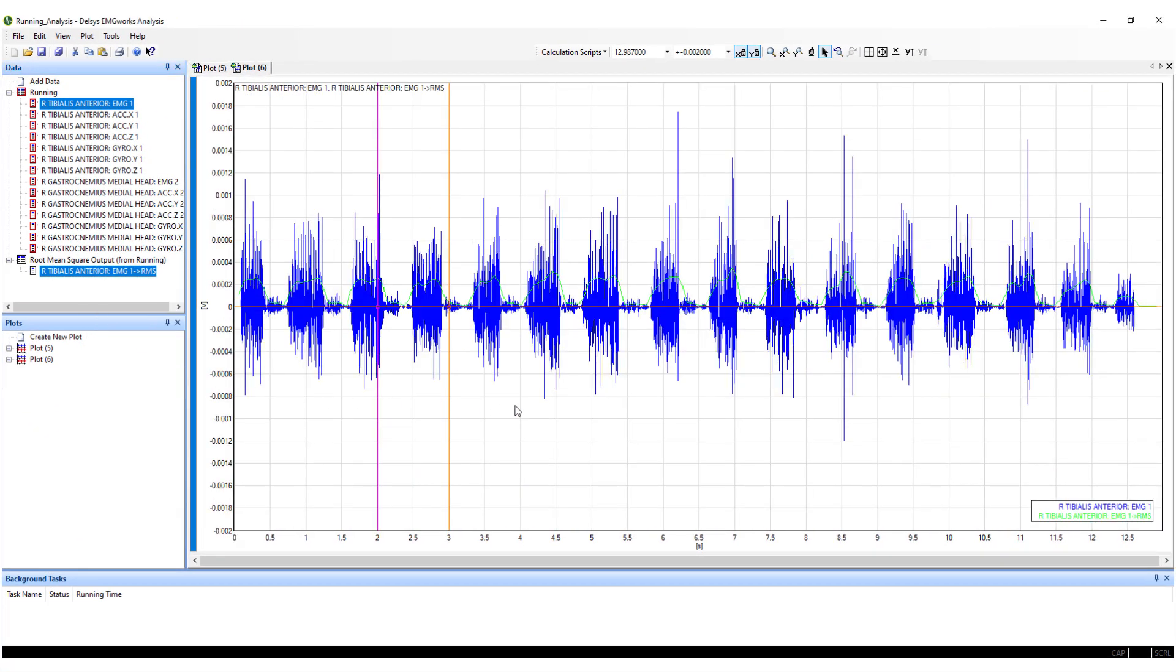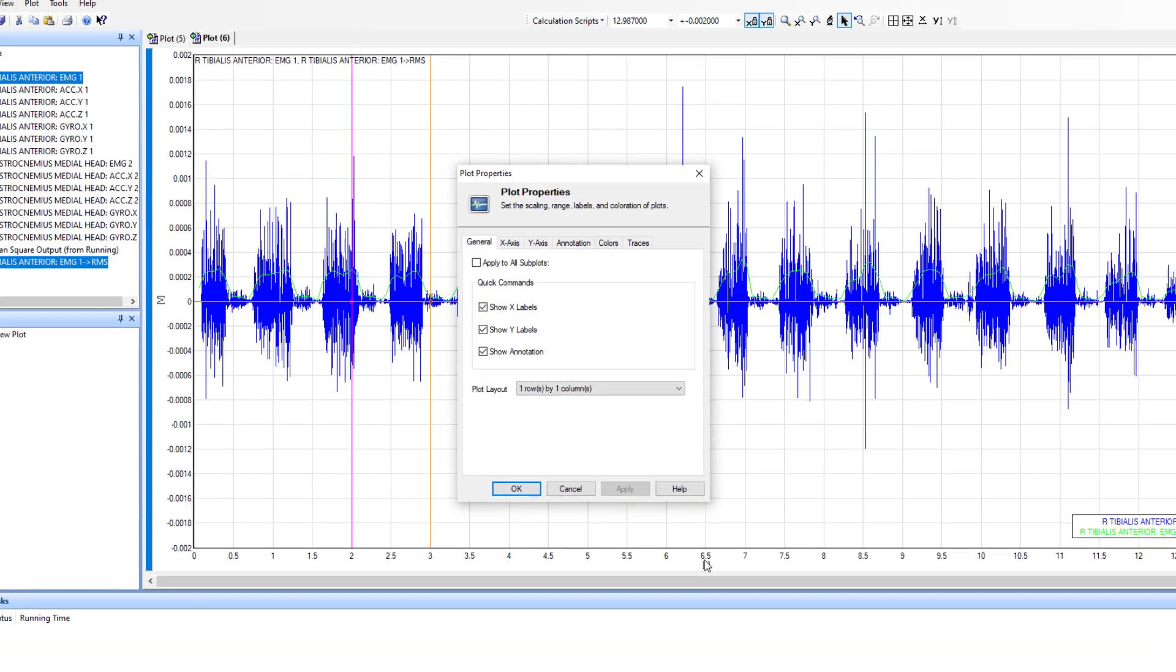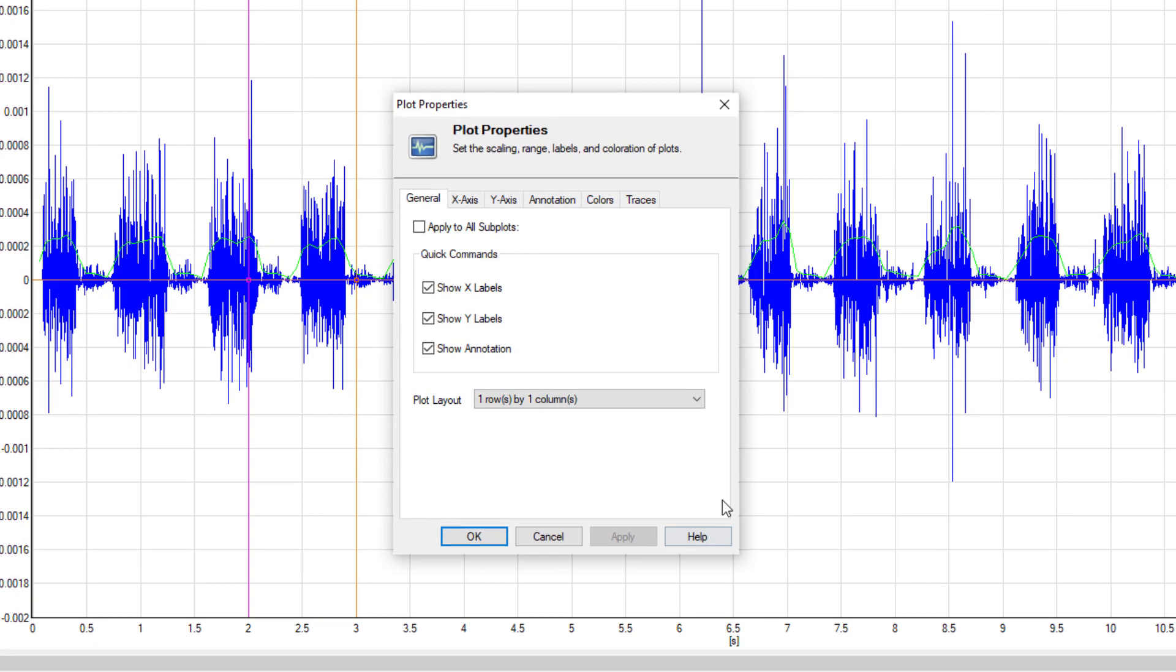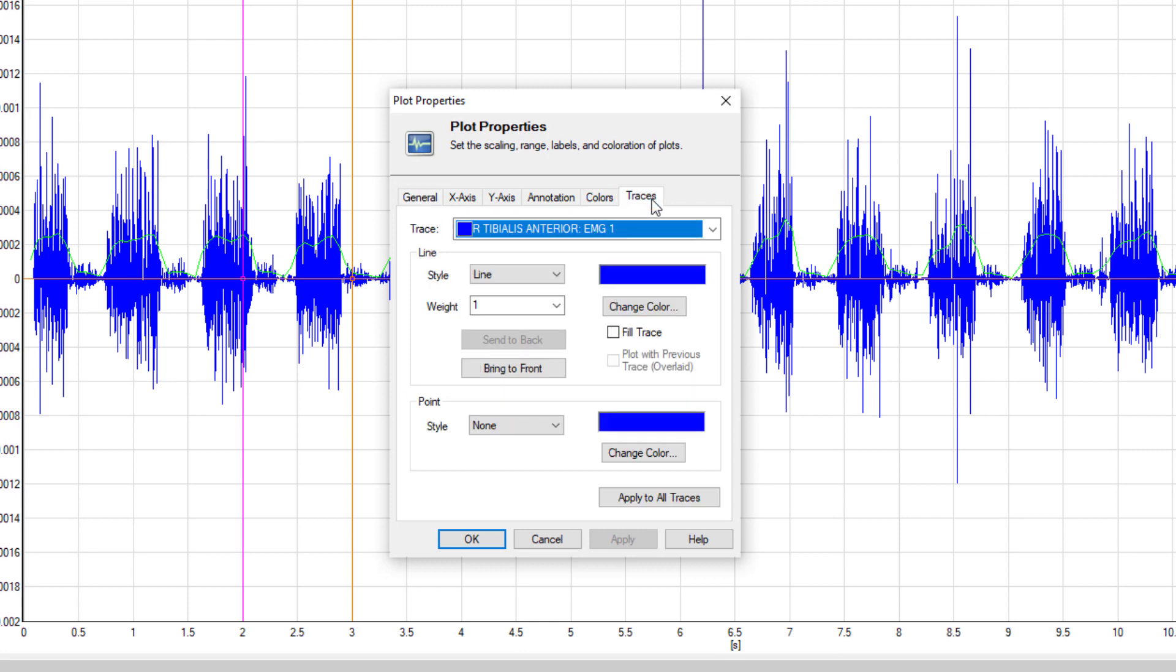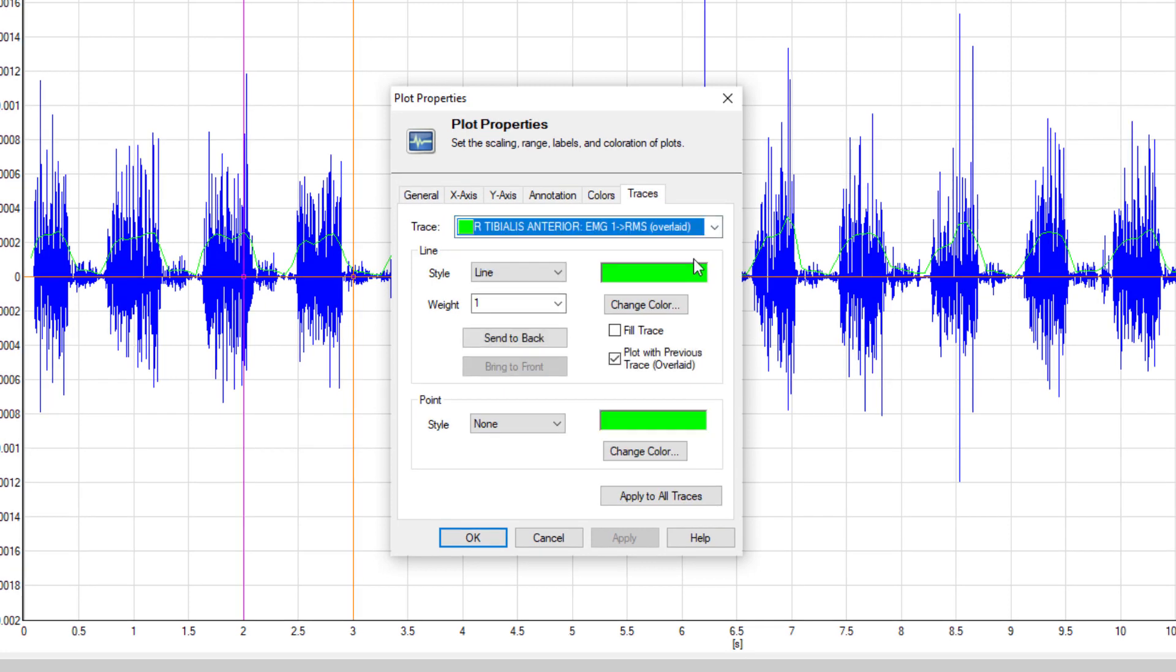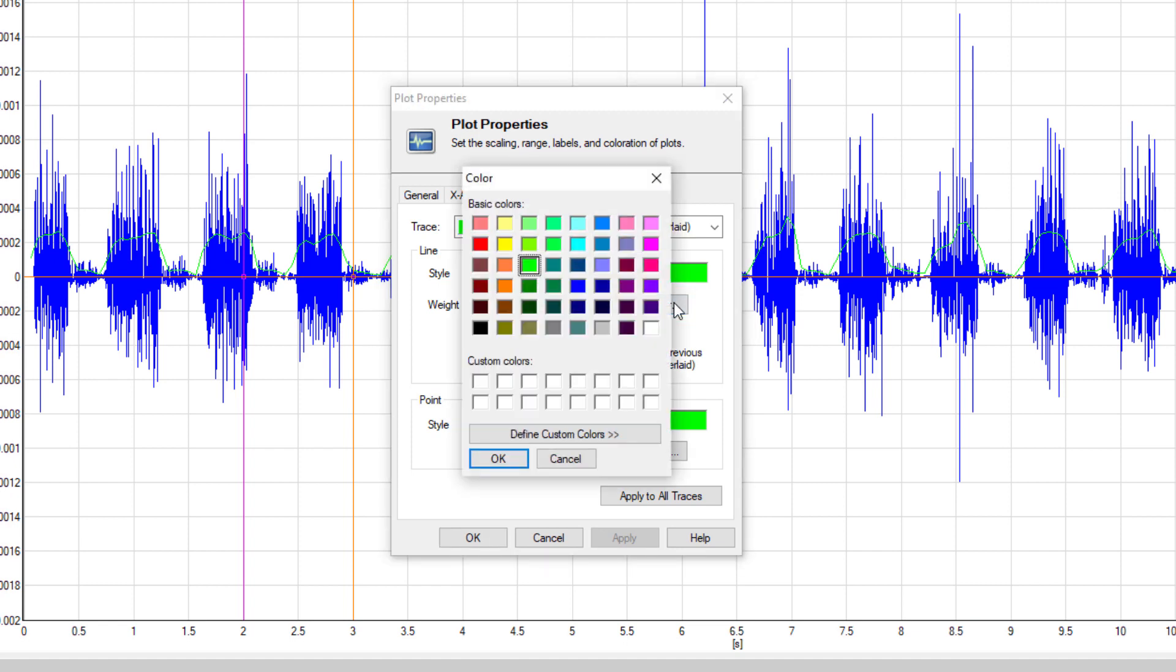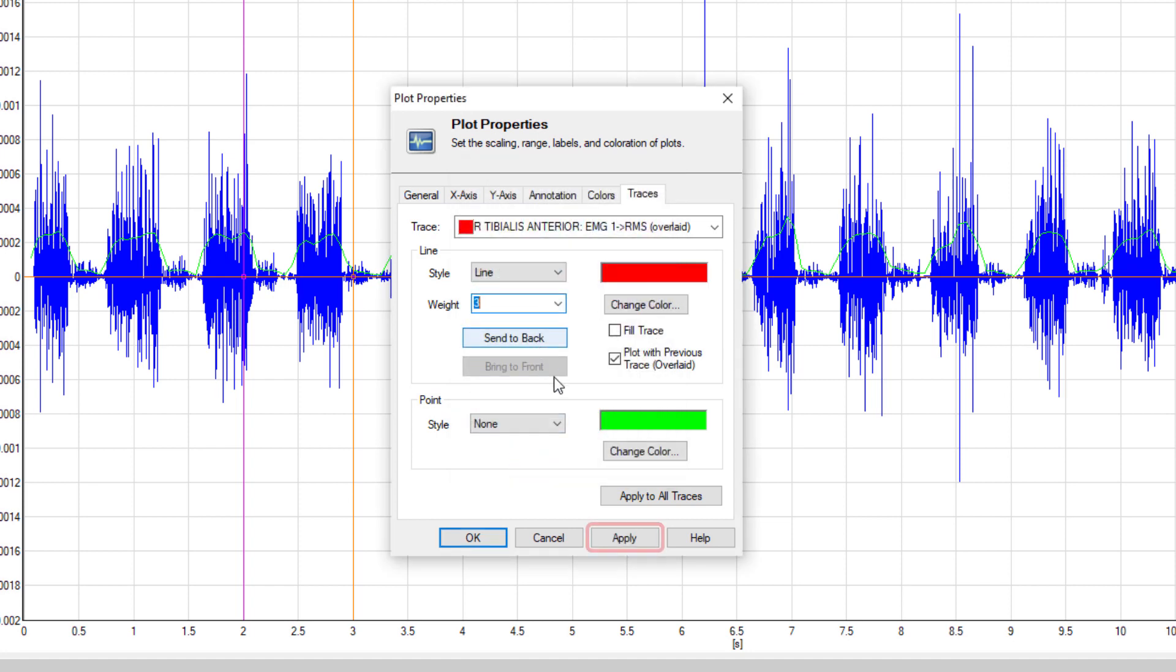The trace color and weight can be changed by right-clicking the plot and selecting Properties. Navigate to the Traces tab and select the channel to alter. Select Change Color to choose the new color and adjust the weighting of the line. Click Apply to commit the change and OK to close the window.